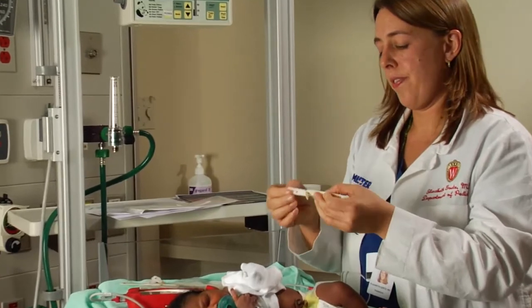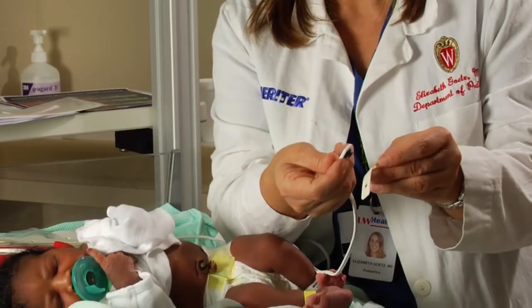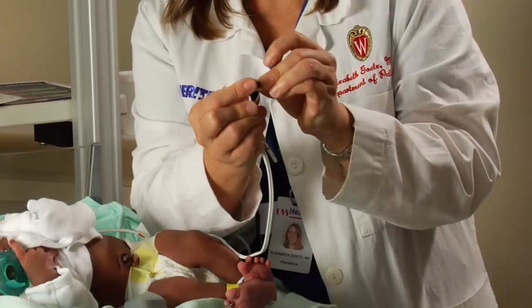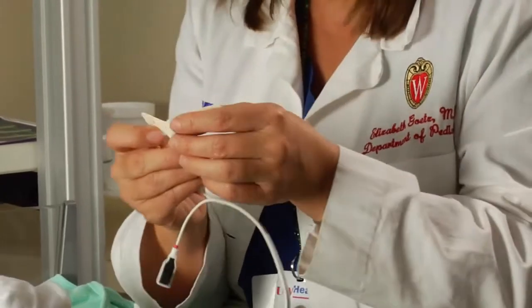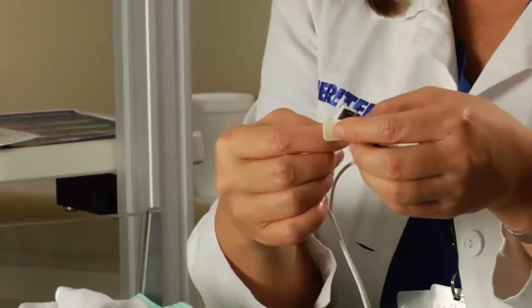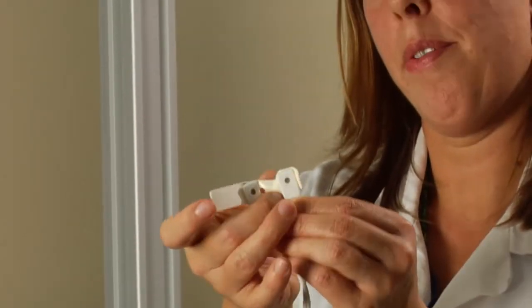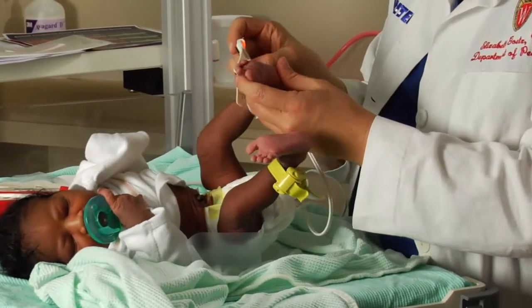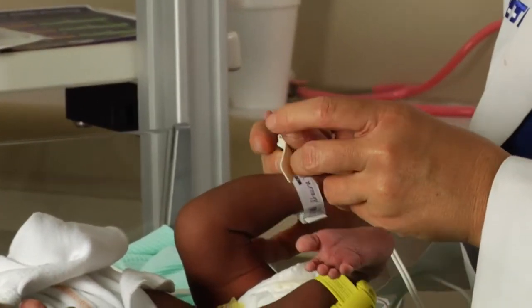And all you do is insert the little black buttons into the holes. I always think of it as the sensor goes on the sticky side. And then those will go right in just like that, so that it looks just like this on the sticky side of the sensor. Then we'll measure the pulse ox in the baby's foot. So again, I want to make sure that I have the sensors directly against the skin without a lot of extra space in between the sensors and the skin.